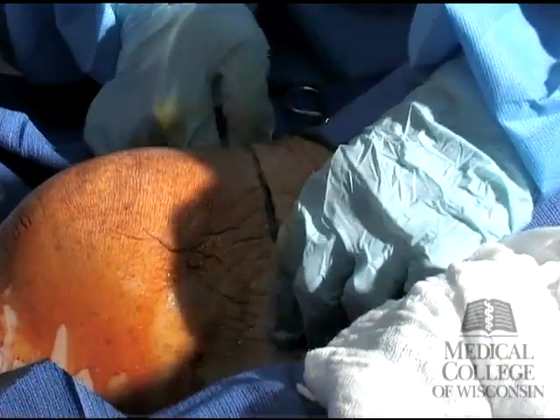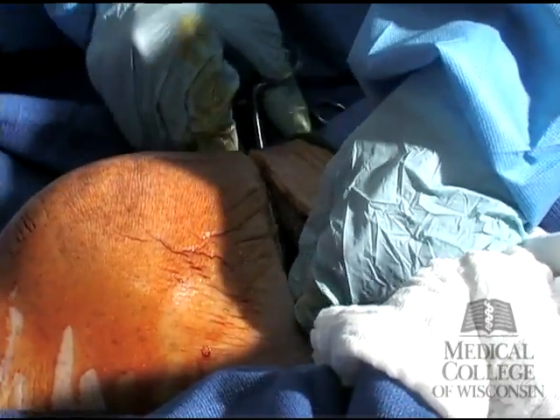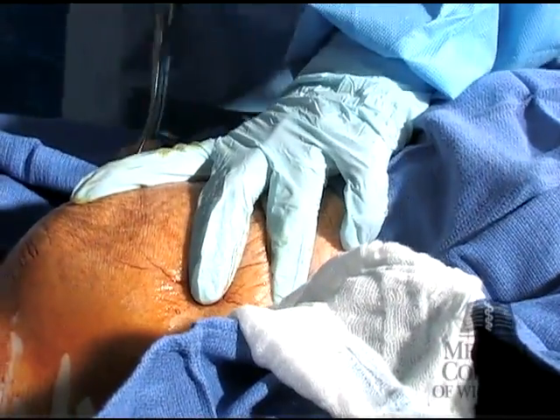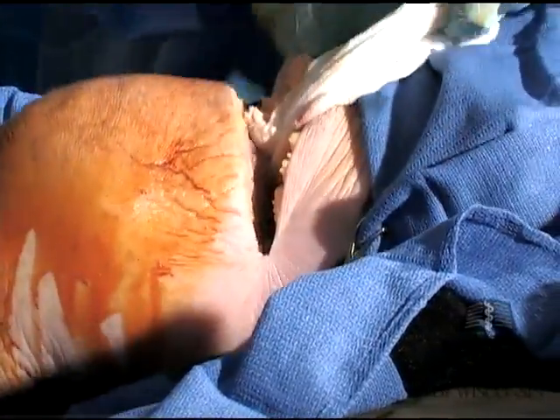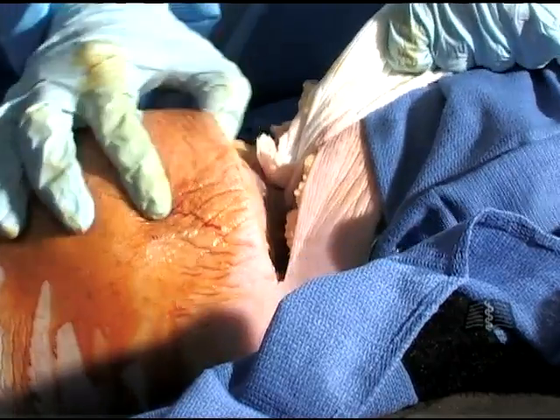Take a corner of a laparotomy pad and place it within the jaws of the clamp and pull through to allow the lap pad to be underneath the bone. Remove the clamp. Grab both ends of the lap pad and move in a back and forth motion to further dissect the soft tissues away from the bone. Grab both tails of the laparotomy pad with the left hand and use as a handle for retraction, pulling towards the patient's head.